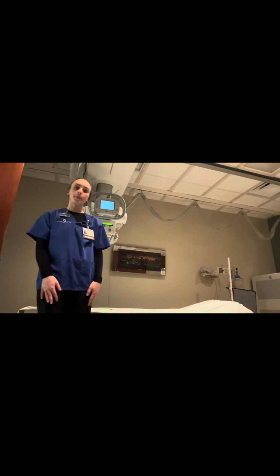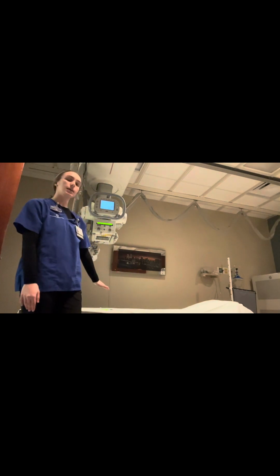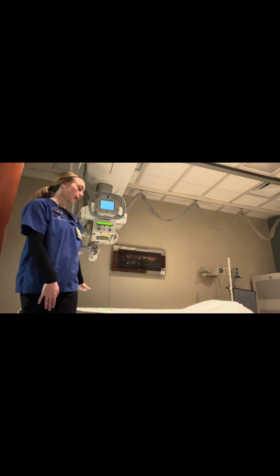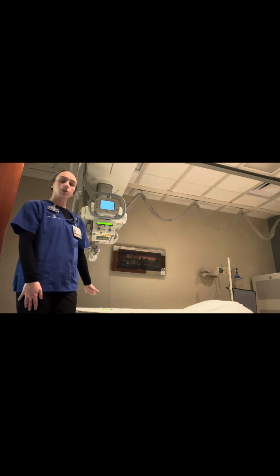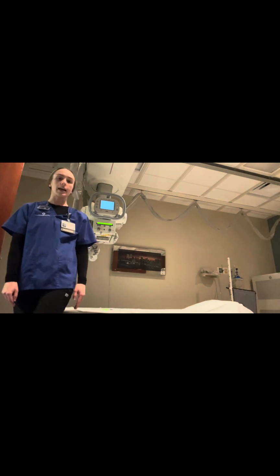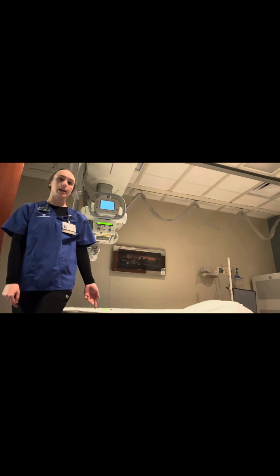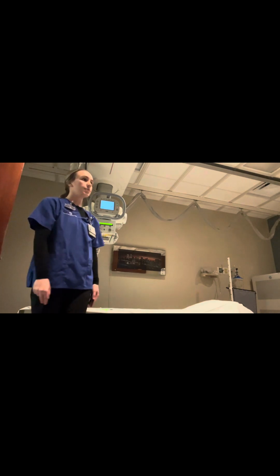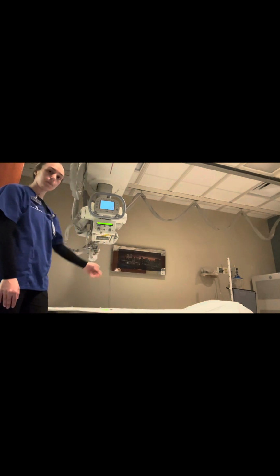Before I went and grabbed my patient, I ensured that there was a sheet on our table here. And since the body part we are imaging is less than 10 centimeters, we are going to be doing this tabletop as well as non-gridded. The typical projections for a tib fib or lower leg is AP and lateral, and we are going to be starting with the AP view. So I'm going to have Lexi come on over and lay on her back on my table here.